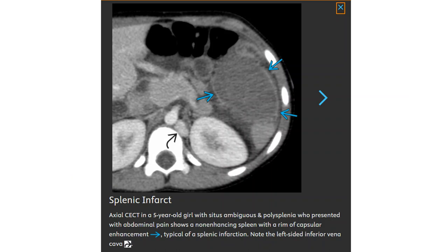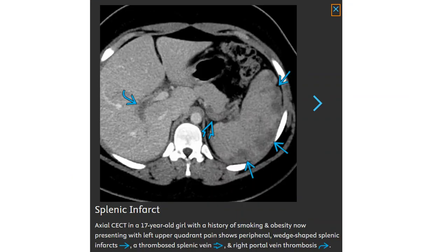Note the left-sided inferior vena cava. This is a contrast-enhanced CT in a 17-year-old with a history of smoking and obesity, now presenting with left upper quadrant pain, showing peripheral wedge-shaped splenic infarcts, thrombosed splenic veins, and right portal vein thrombosis.